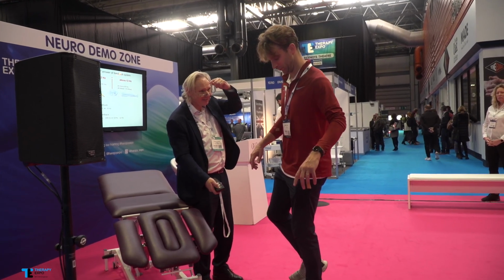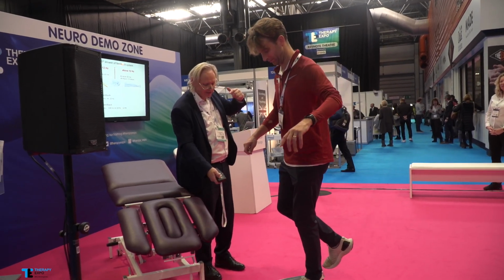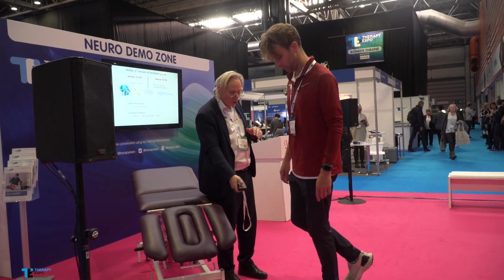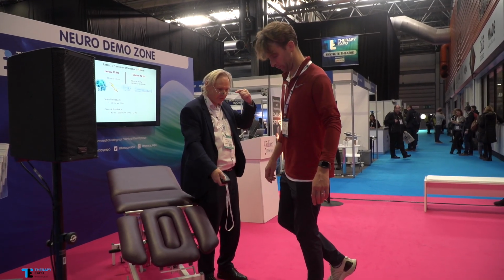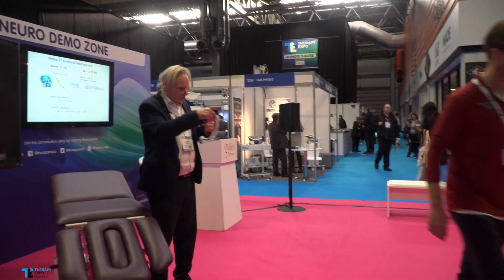You feel this? Yeah. So if I go high, then it's easy. Then we have the spinal feedback system. If we go low, then his brain has to take over, and it's getting more difficult. So he has to think about this. Okay, thank you. So stay here, stay here.